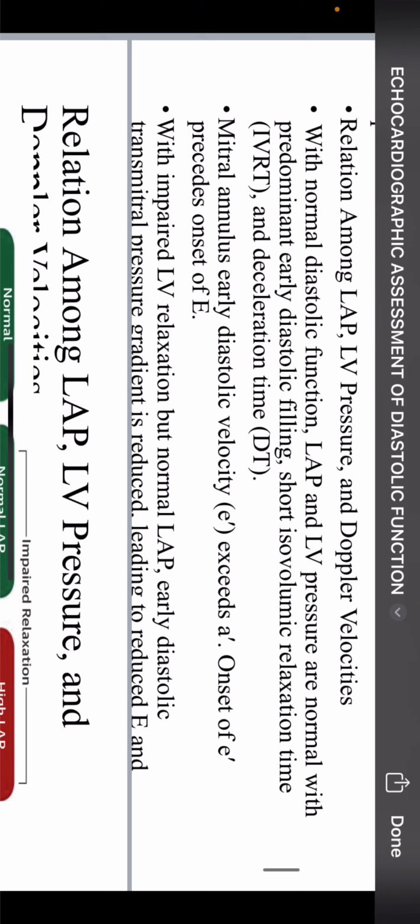So from mitral E, we can also record the mitral annulus. If you remember anatomy, a valve is surrounded by a fibrous ring, that is the annulus, where the leaflets are held and supported. The annulus movement can be recorded using tissue Doppler, pulse tissue Doppler, TDI. As with the inflow velocities, we have two annular sites: the septal, towards the interventricular septum, and the lateral, towards the lateral side.